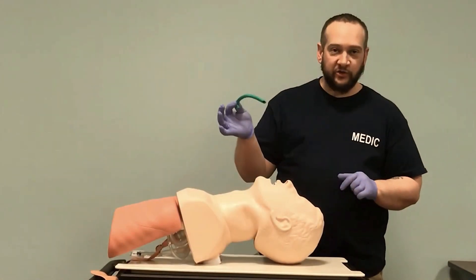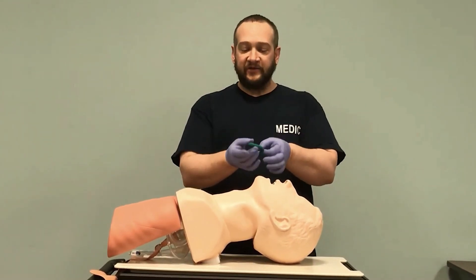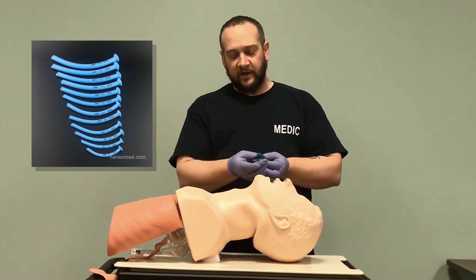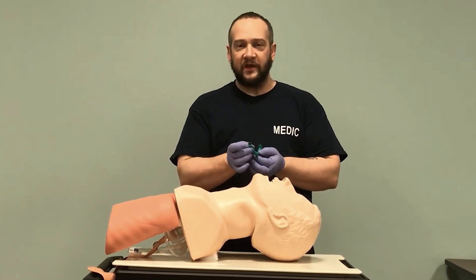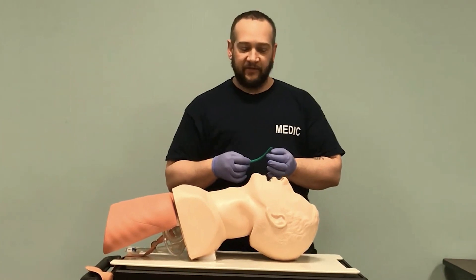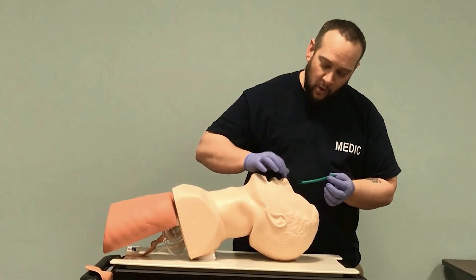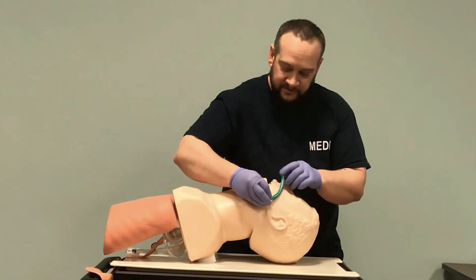When we measure for sizing, these come in different sizes — those French sizes. We look at the internal diameter and also the length. For the nasopharyngeal airway, we're going to measure from the nose to the tip of the ear.